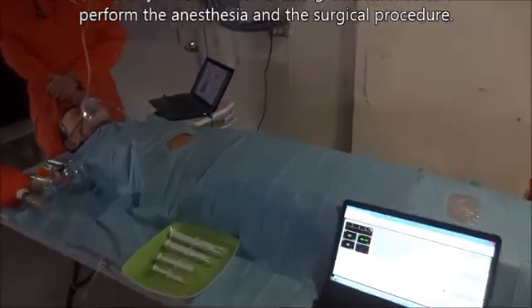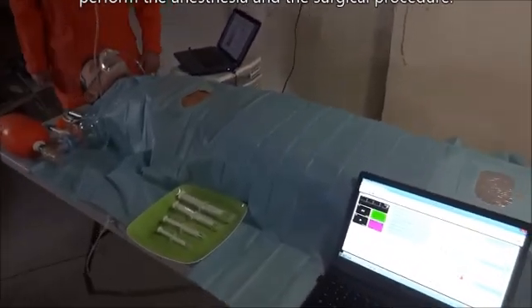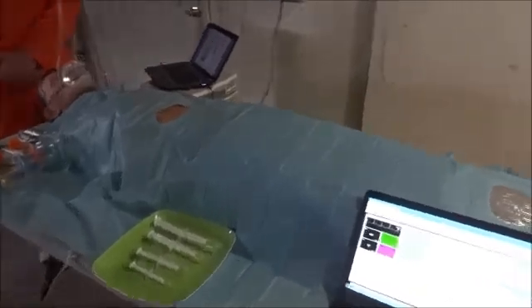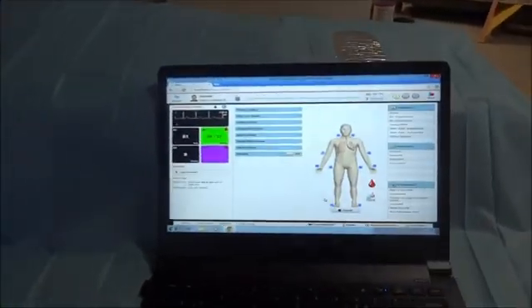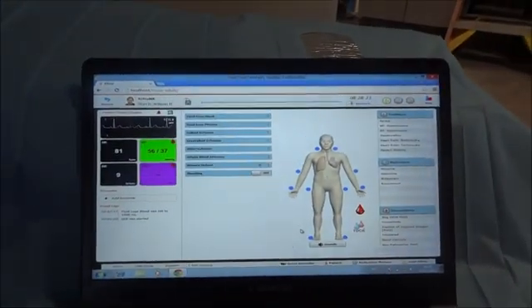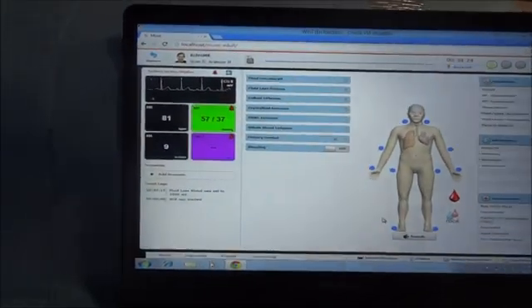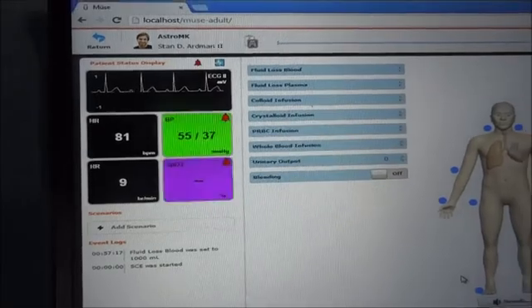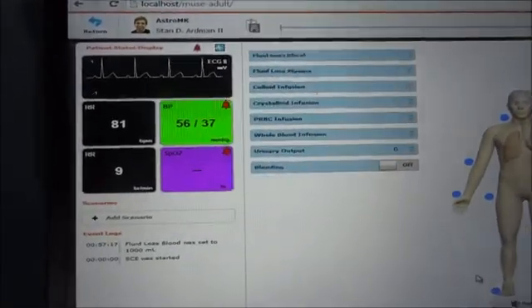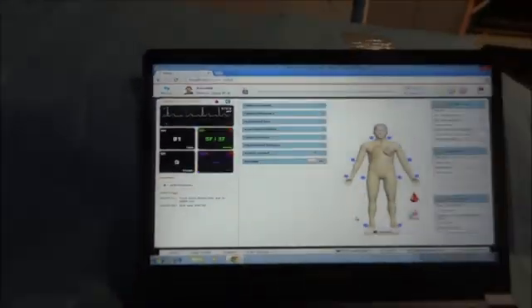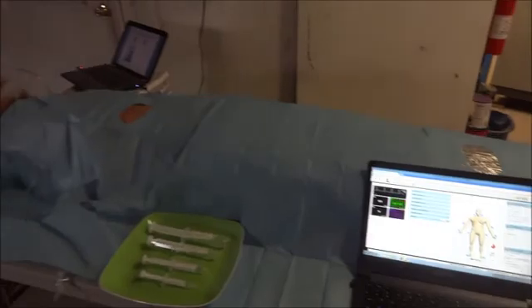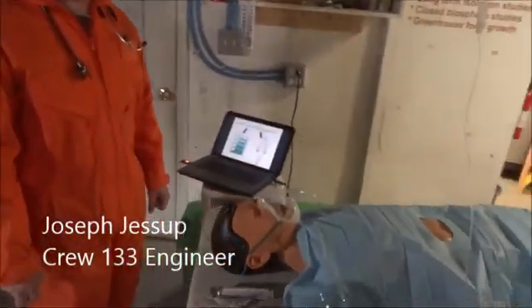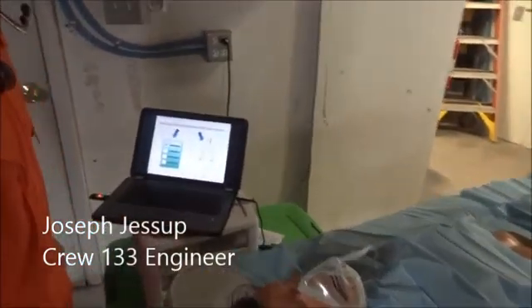We're just about to start the scenario, the simulation. A patient has been brought in the hub, has been installed in the surgical table, all the monitoring equipment is in place. Unfortunately, his blood pressure is really low because he lost a lot of blood, and he's deconditioned by lower gravity. Joseph here is just about to start the flowchart.